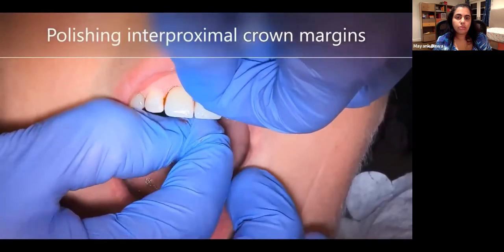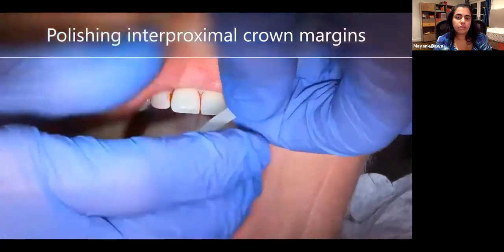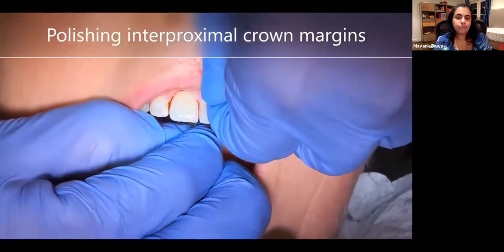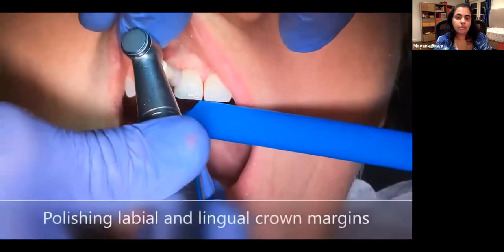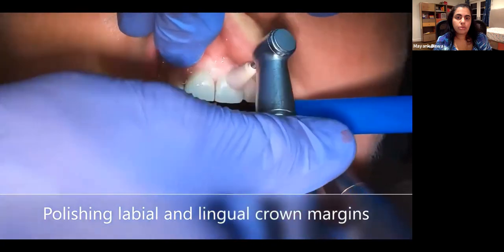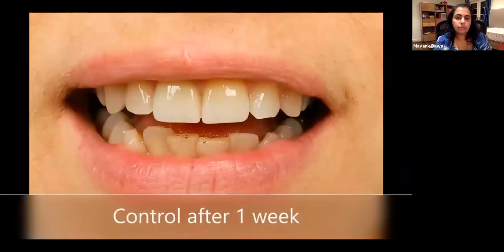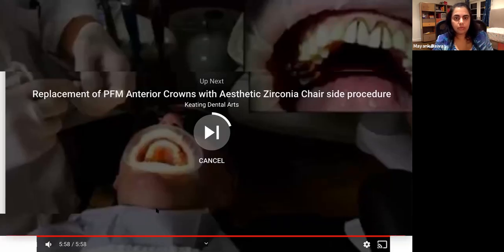They're polishing the interproximal crown margin. And if there's any excess cement left, that will also be taken care of, very gently with this. Polishing the crown margins. All right.